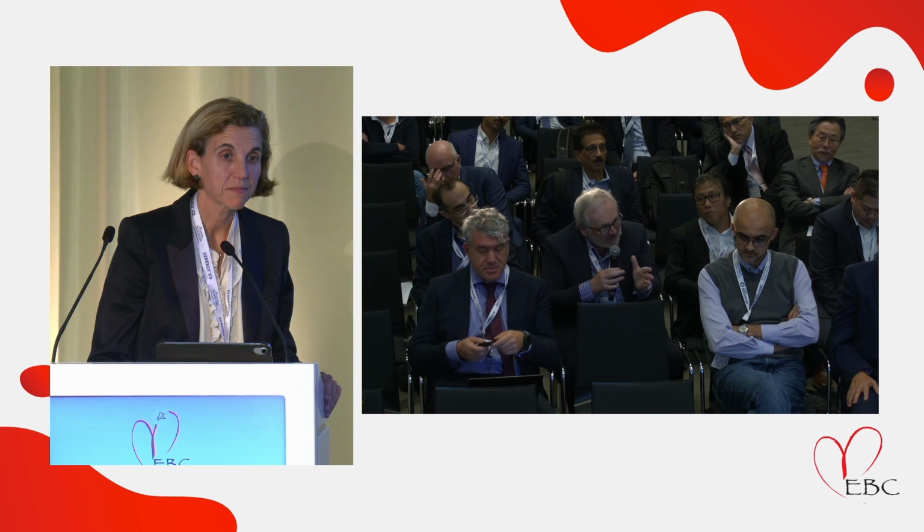Because even in your illustration after the lithotripsy, you could see that you split the thing in 2, but after the stent, there was still something major at that side. So my impression is that when you look at the orbital, when you look at the rotablator on these erupting calcified nodules, they do very little, as a matter of fact. They make a small cut in, but not very impressive. I think lithotripsy, IVL, is probably the way to go.